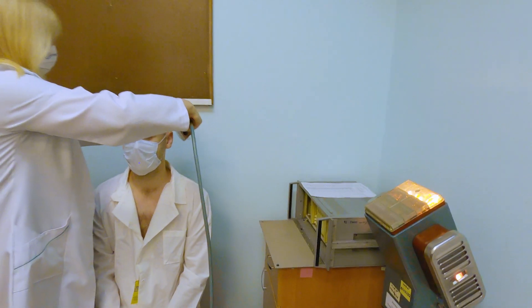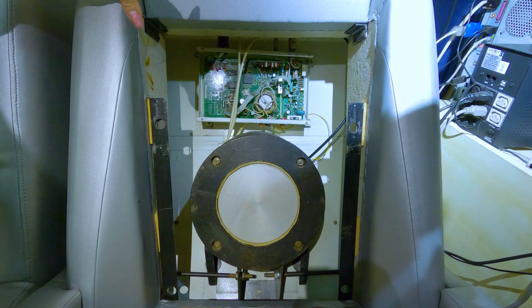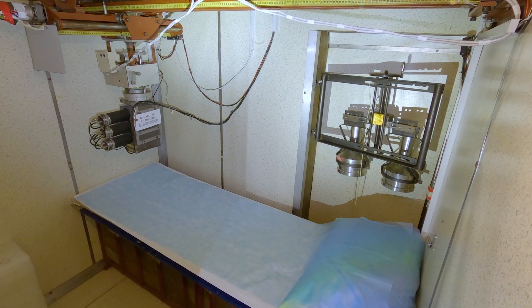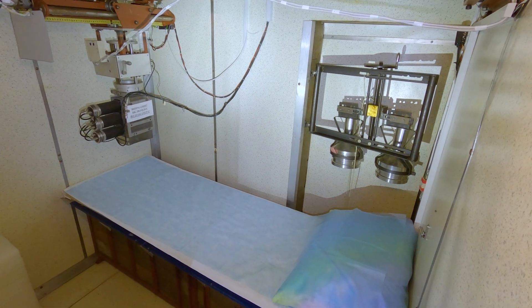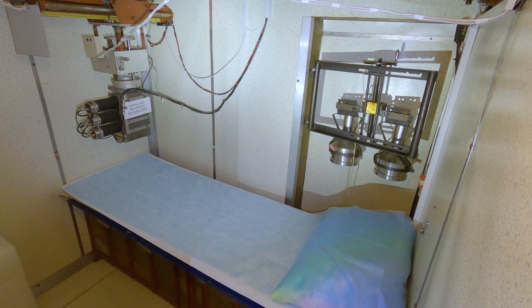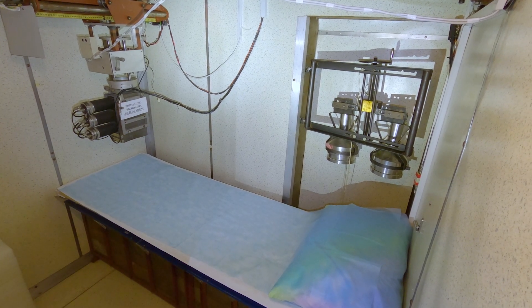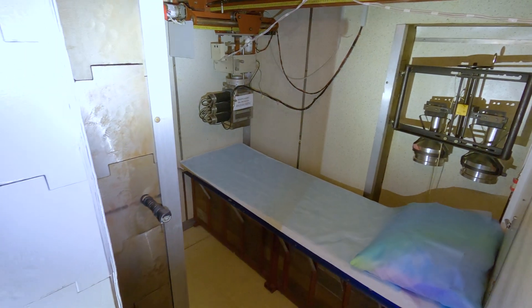You're checked a bit on the chair — it's not very precise, just to give you an idea of how much radiation you have. There's one sensor in the back. Inside there are six sensors under the bed. You have the chest sensor on the right and the moving sensor on the left, for cases when we need to get really precise data from every centimeter of your body.